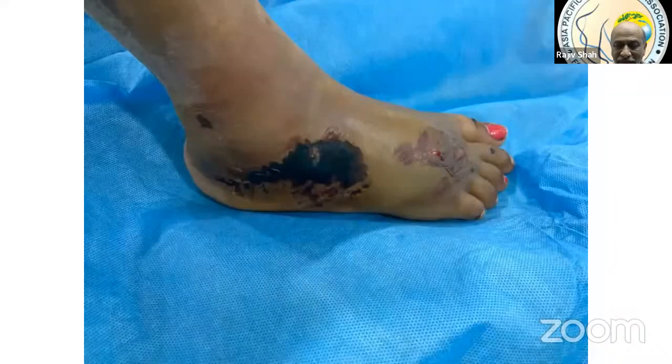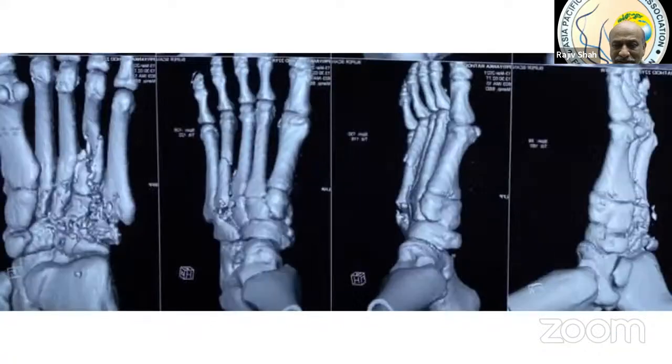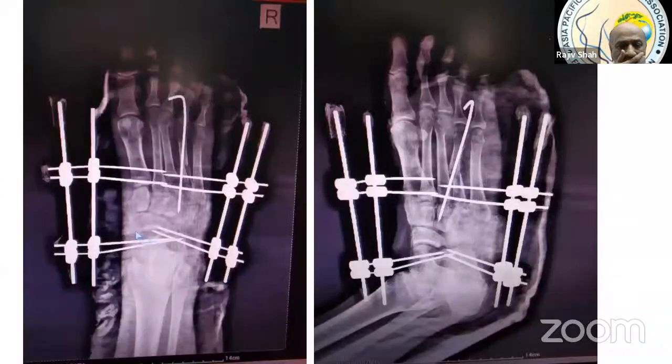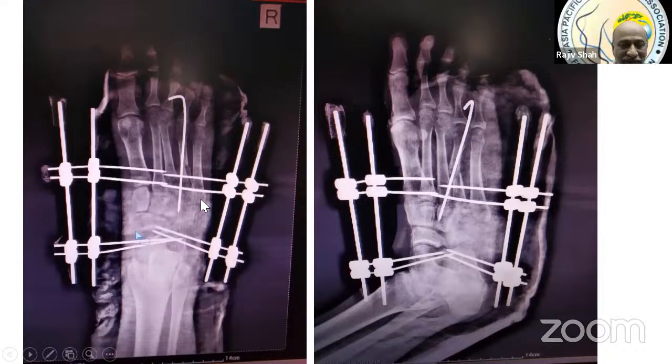External fixator. Okay, so external fixator. Some surgeon sent me these pictures and wanted my opinion. I said, you put in an external fixator. And if you are able to fix the fourth metatarsal with a K-wire, that too with a joint-sparing K-wire without violating the collateral ligaments of the joint. And this is what was done. Yes, K-wire. You have expert people. So this K-wire was out, and this is how he did the fixation, external fixator.